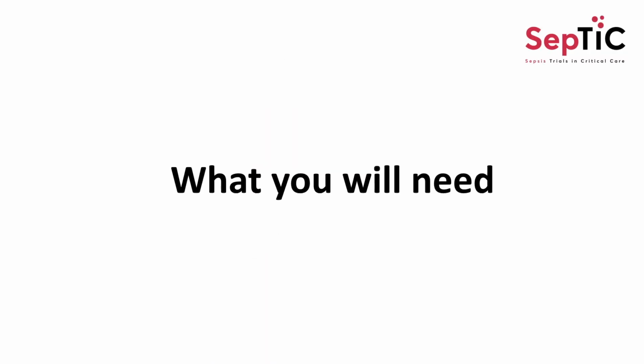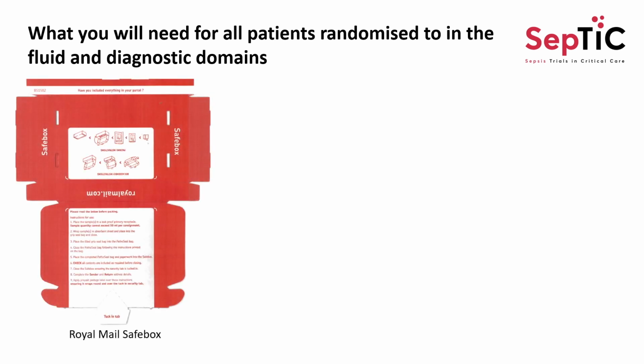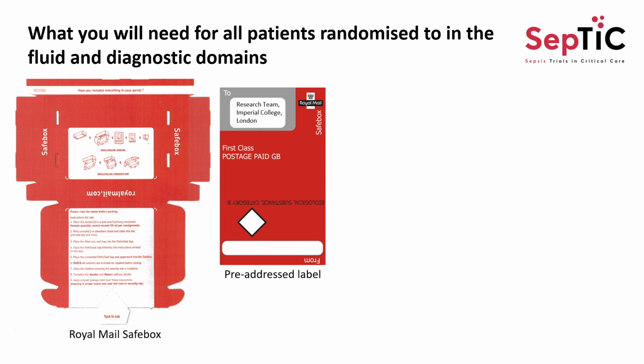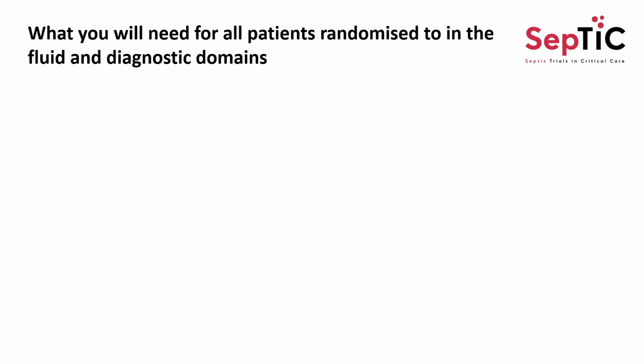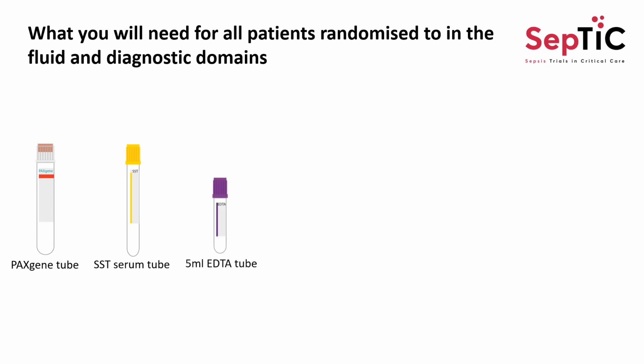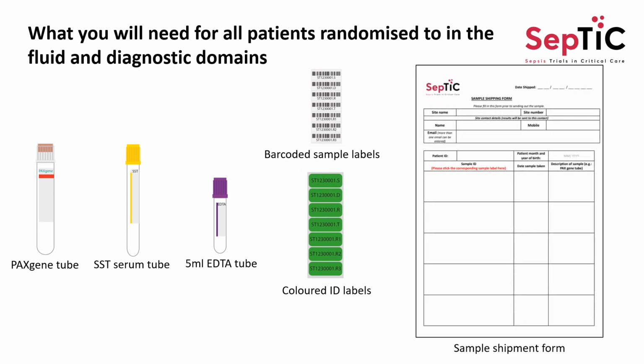The first thing that we'll describe is what you'll need to collect the samples. For all patients that are randomised into the fluid and diagnostic domains, you will receive a sampling pack. The pack contains the following: a Royal Mail safe box, a pre-addressed label, an absorbent pad, a grip seal bag, and a pathoseal bag. You'll also receive the following tubes: a PaxGene tube, SST gold top serum tube, a small 5 ml purple top EDTA tube, some barcoded sample labels in white, some coloured ID labels, and a sample shipment form.